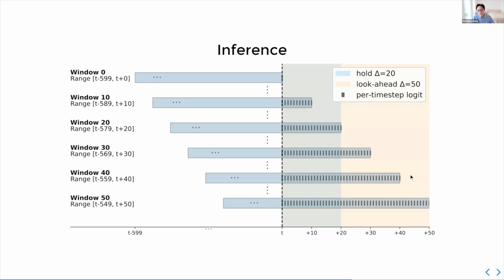But I think ultimately, if you scale your data collection enough, which I know is hard, end-to-end models generally work better for EMG and biosignals in general, given how noisy and non-stationary they are. If you can get enough data with arm movement and hand opening and label these variations, then I think you have a chance at making good predictions on them. Thank you.